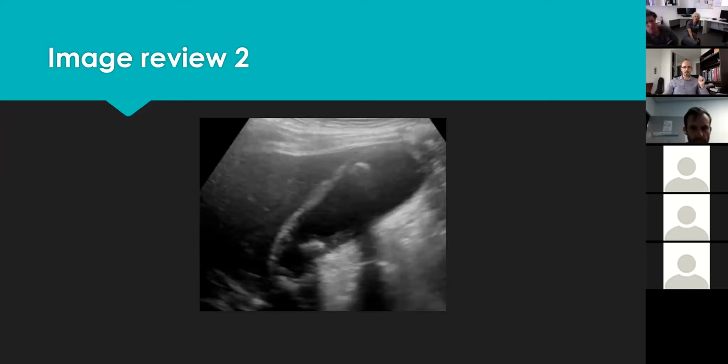If we are concerned about that part, one thing you can do is to get a transverse view of the gallbladder, get the patient to breathe in, to move the gallbladder further forward, and then you can get that part pretty much perpendicular to your ultrasound beam and measure it in line with your ultrasound beam, which would be your vertical resolution rather than relying on your lateral resolution. Good.